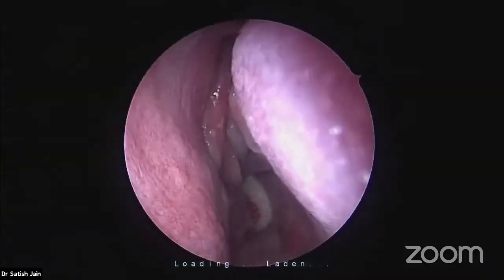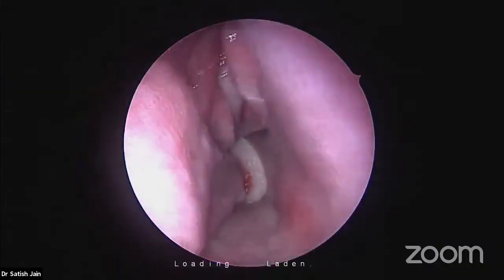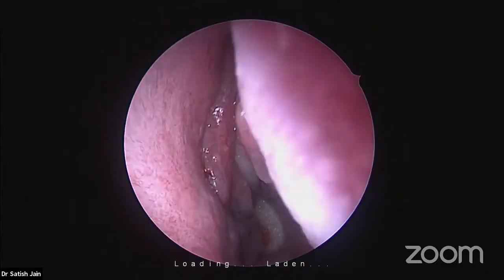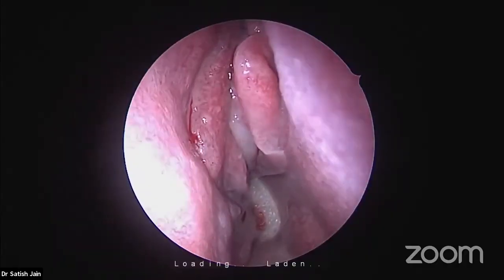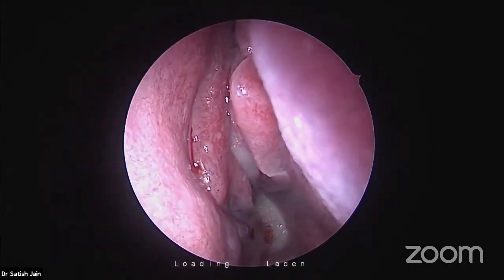Now this is about the preparation part. I told you, 5 to 10 minutes, it is topical application. I keep the head 15 degrees up for better venous drainage from the head. This is the only preparation we do intraoperatively. No injection, no infiltration.